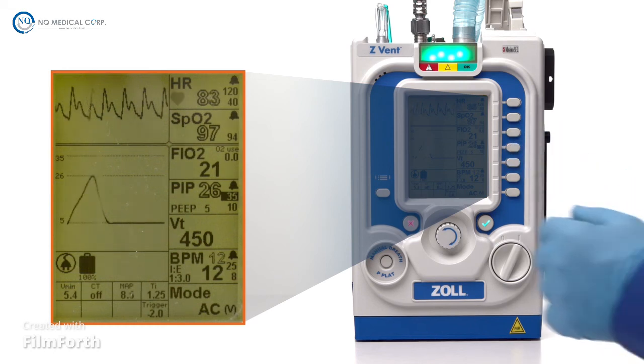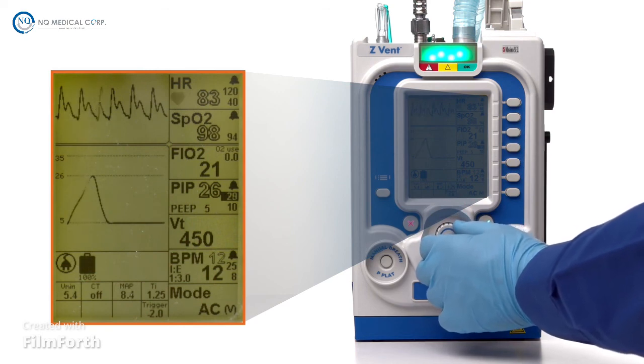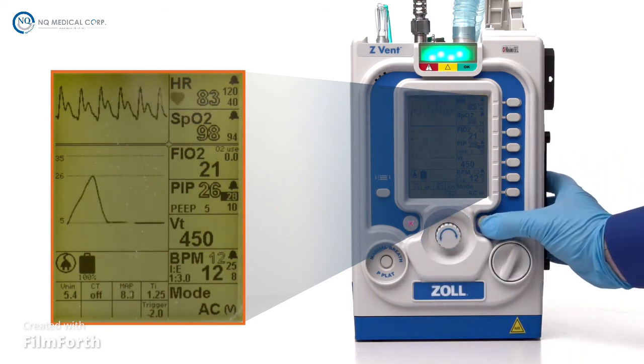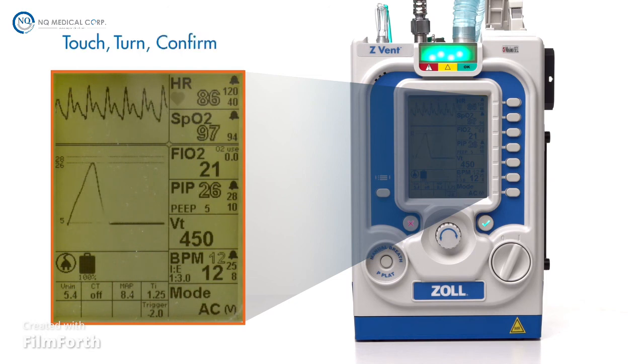Use the selection dial to adjust the value up or down as needed. Once the desired value is reached, confirm the change by pressing the Accept button. The parameter is now changed. Remember, touch, turn, confirm.